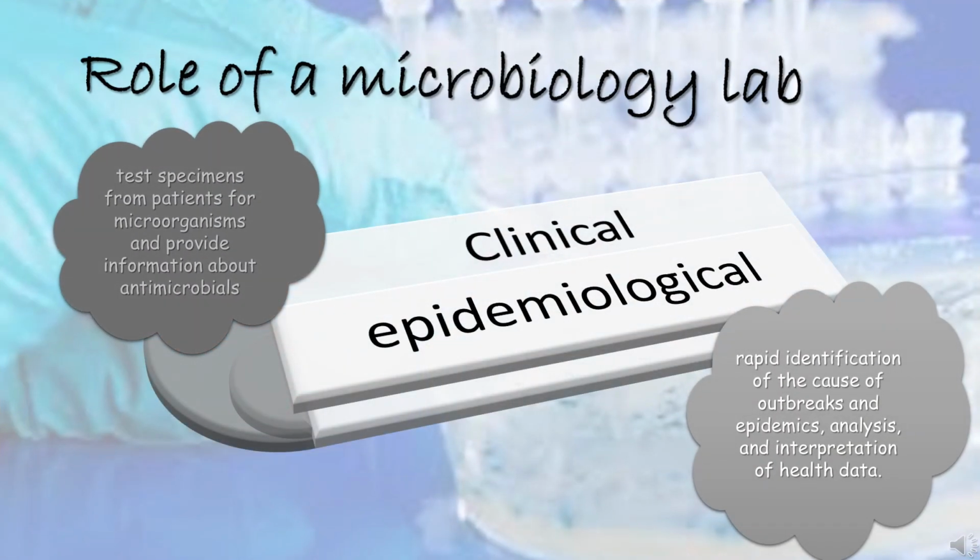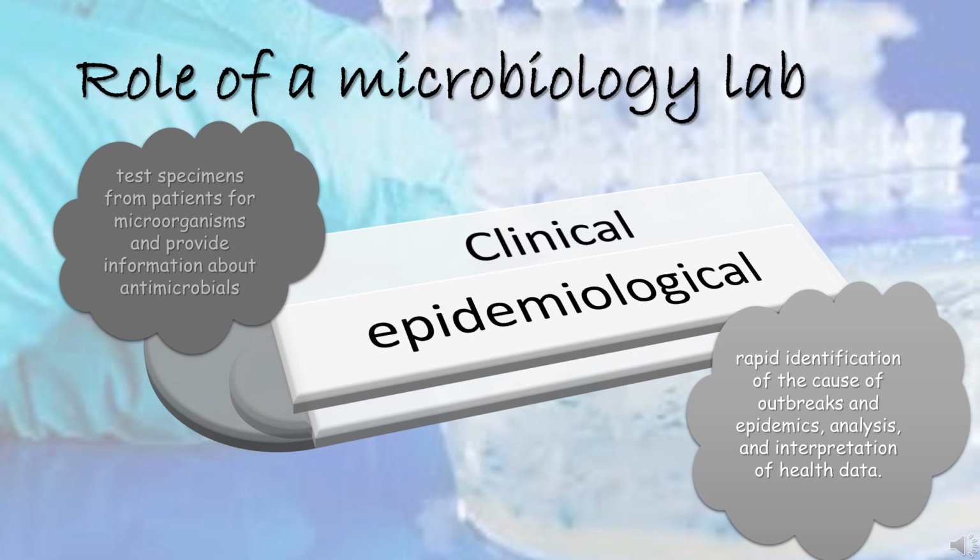The isolation and characterization of microorganisms inflicting infections performed by the microbiology laboratory play two important functions. Number one is clinical, in which a microbiologist has to test specimens from patients for microorganisms that are, or may be, a cause of the illness and to provide information, when appropriate, about the in vitro activity of antimicrobial drugs against the microorganisms identified.